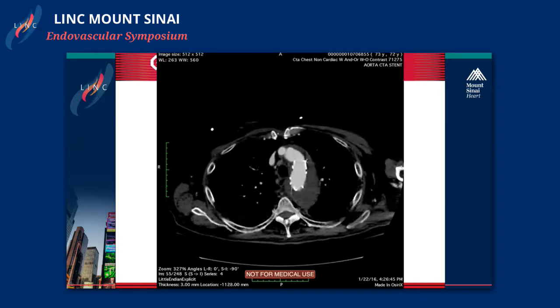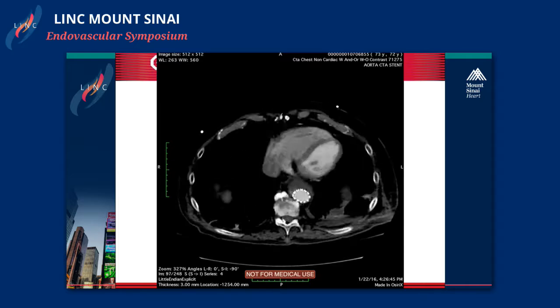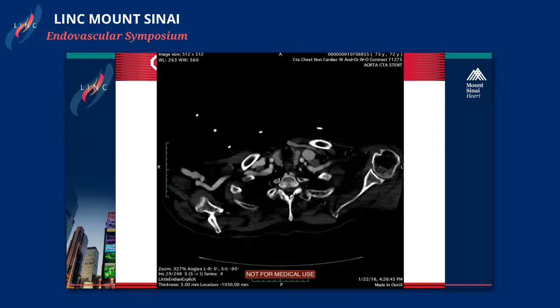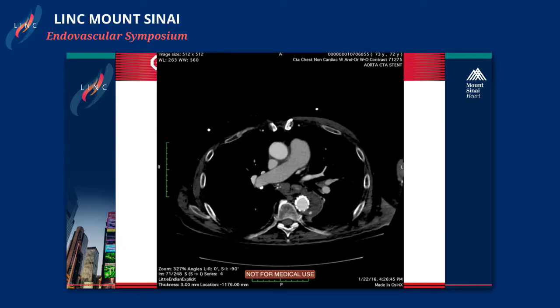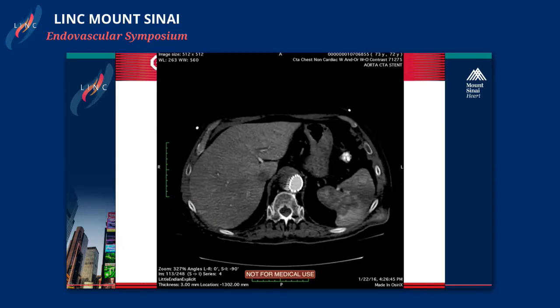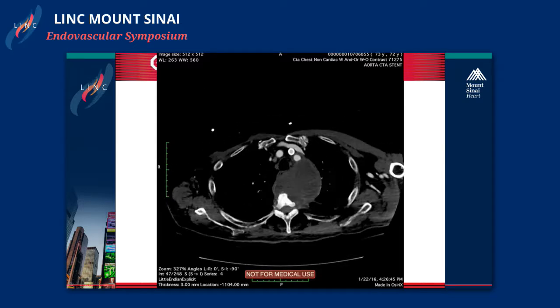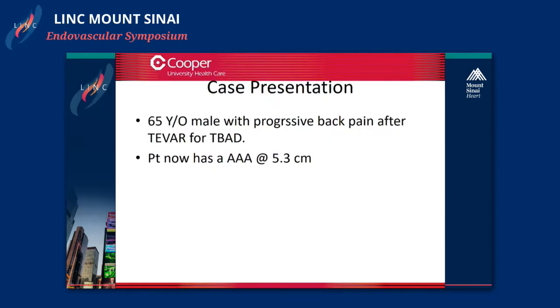And then the subsequent CAT scan shows complete thrombosis and regression of the aneurysm, in addition to some persistent false lumen flow distally, but we're still observing that, and nothing to do there unless he dilates later on. So that one little entry tear in the common carotid artery. Again, entry tear ambiguity is another reason some of these fail.